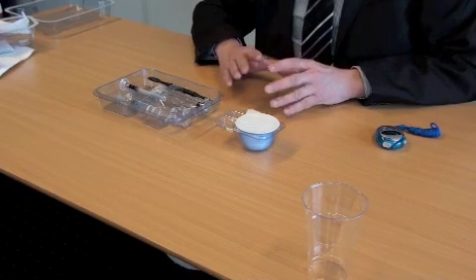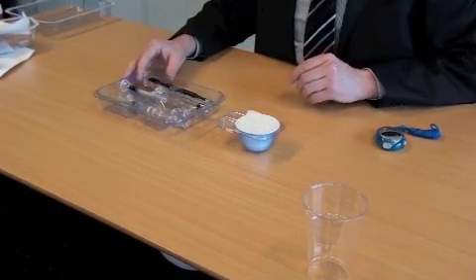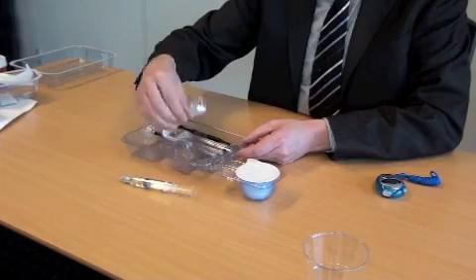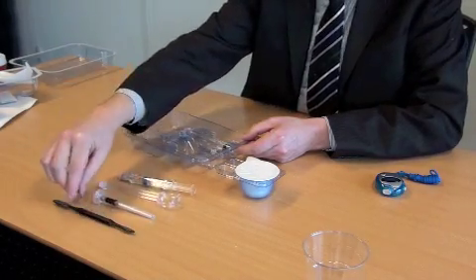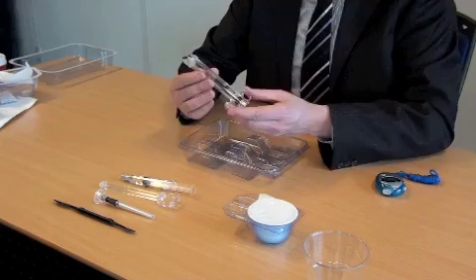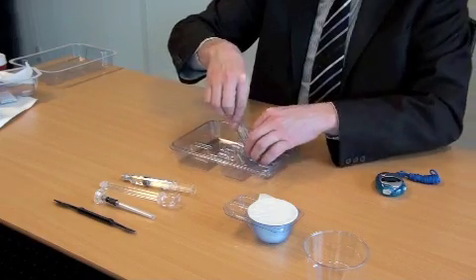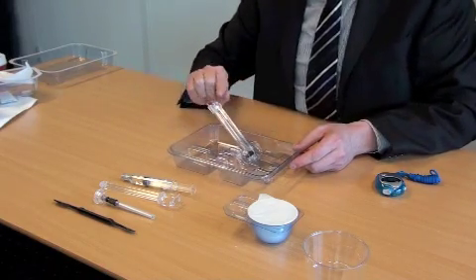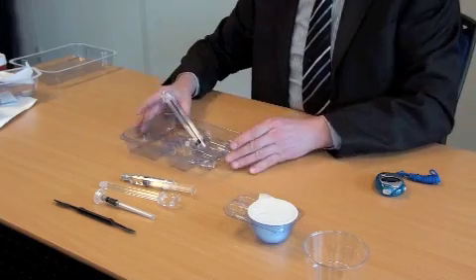So now, before preparing the Hydroset, we're just going to make sure that all the instruments actually are at your disposal. So what we do first is we take out the syringe with the liquid, we take out the plunger, we take out the cannula, we take out the spatula, and then we're going to make sure that the syringe, which is going to collect the Hydroset, is clicked in this tray like this. Click. And you see that it is positioned in an angled position, 45 degrees, with the opening on the top. Okay, we're just going to put it over here.